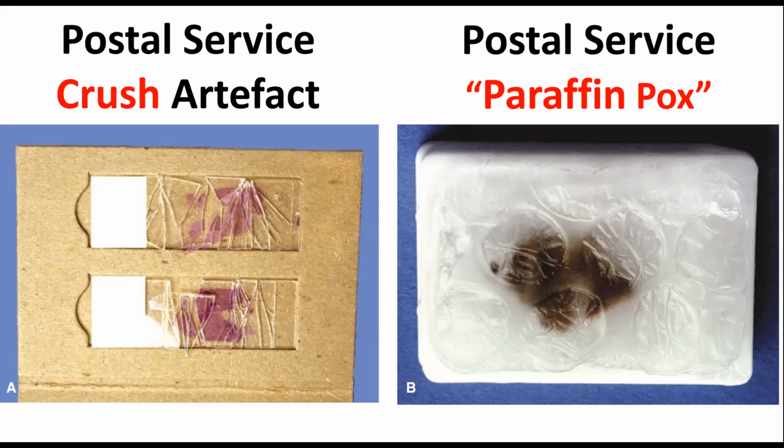Most famous case that sticks in my mind, the most famous case to me from the Duke era, was a case just like this, where one of these fragments, maybe it was a triangle piece, was just big enough to cover the aperture on the stage of the microscope to look at, and it was herpes encephalitis, beautiful intranuclear inclusions. Now, is that life or what? It's like one of these priceless biopsies where you have these giant Cowdry type A inclusions, herpes encephalitis, and the slide comes in looking like this.